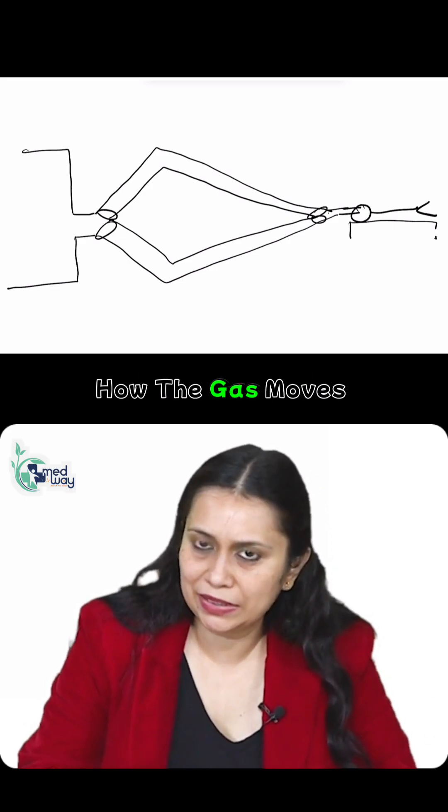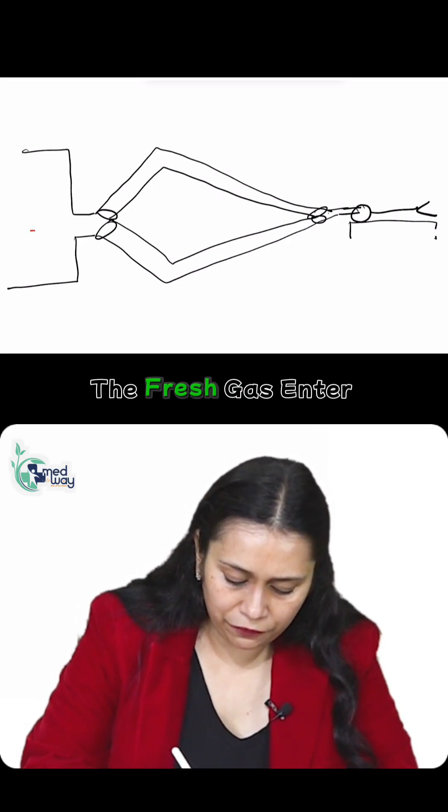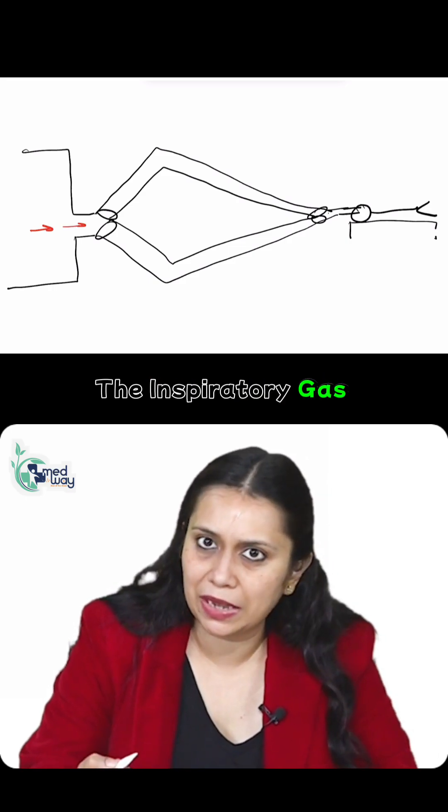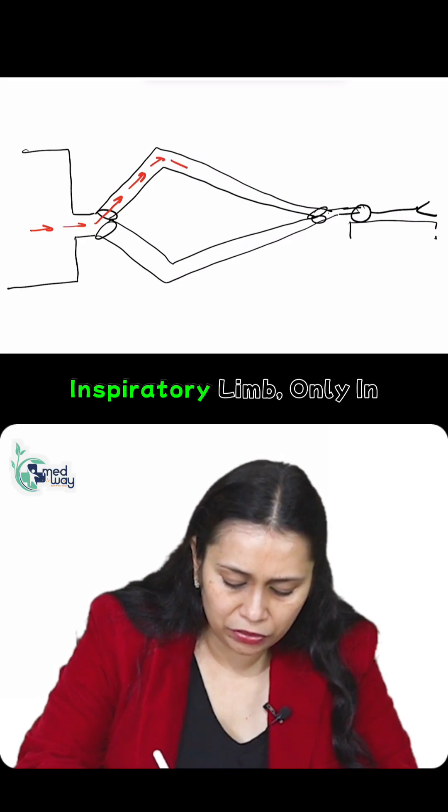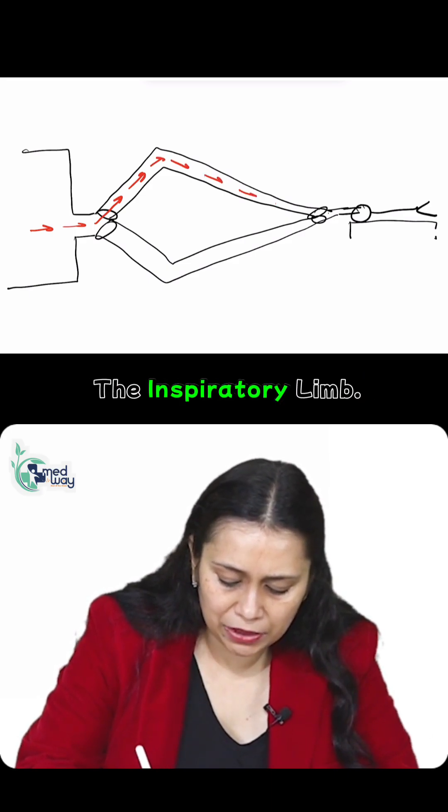Okay, so now let's see how the gas moves. From the machine, the fresh gas enters. It enters through this one-way valve only in the inspiratory limb.